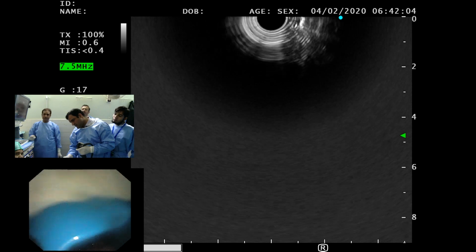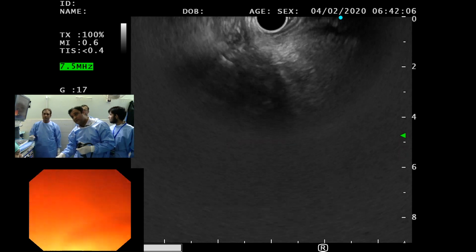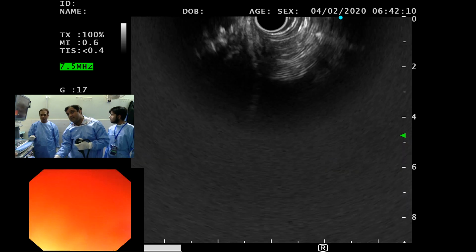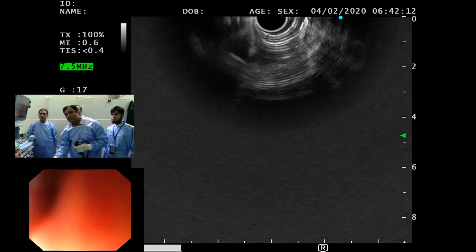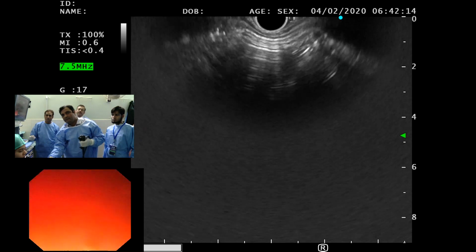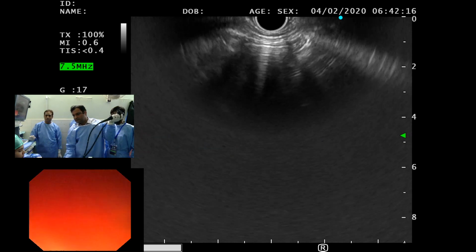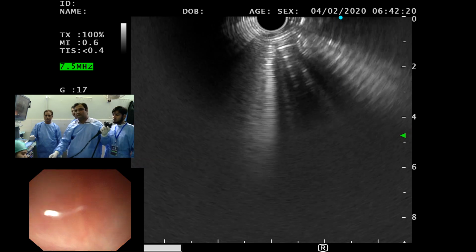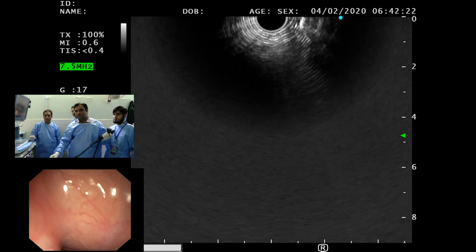Okay, I've made an initial scan. I've had an initial impression what exactly the patient is suffering from. I've given the endoscope to Dr. Shafkat. He's going to make progress. Obviously, first thing is intubation. He has done the intubation in a nice way. He has been able to go down into the esophagus.